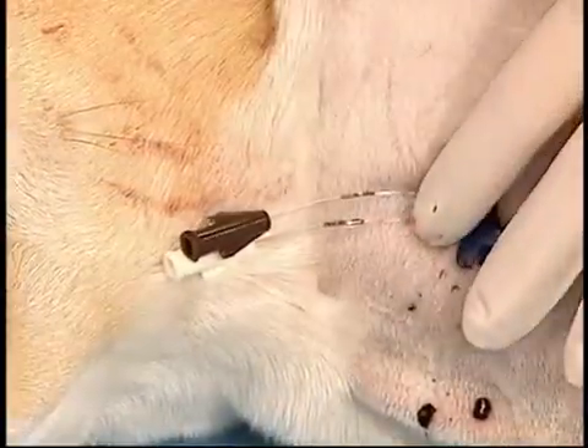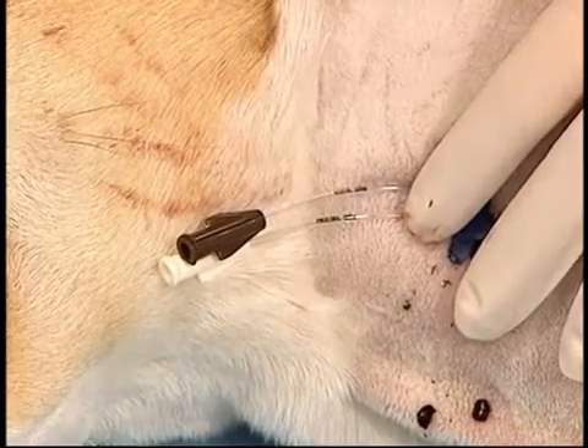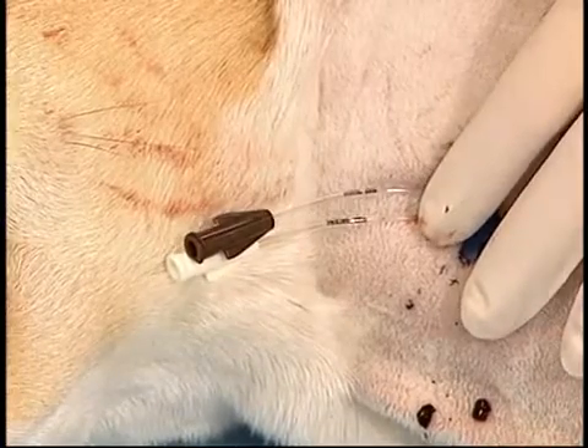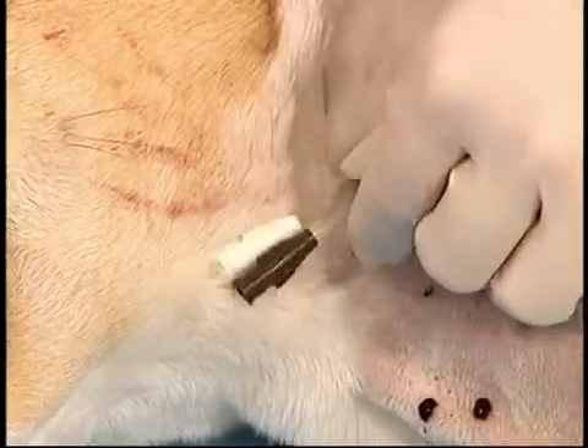Multi-lumen catheters come with two or three lumens. Each lumen is identified by its gauge and location. The advantage of multi-lumen catheters is that irritating or incompatible fluids can be administered simultaneously, since the exit ports are at different sites on the catheter.